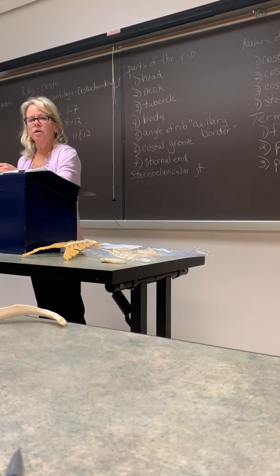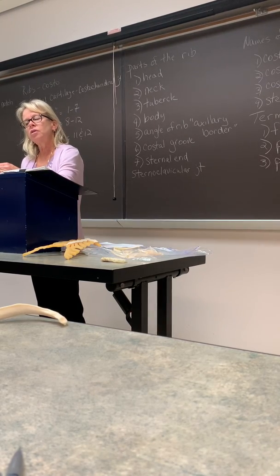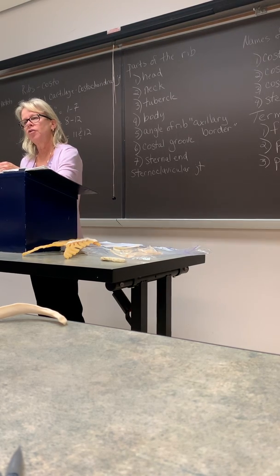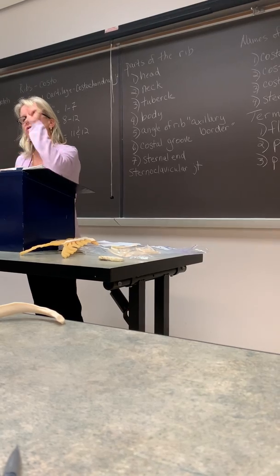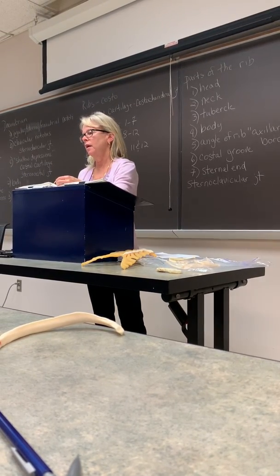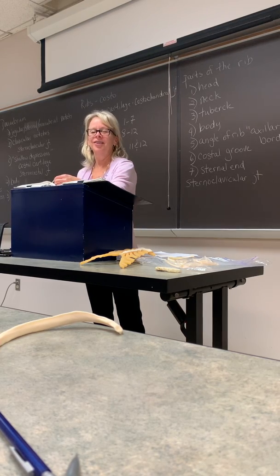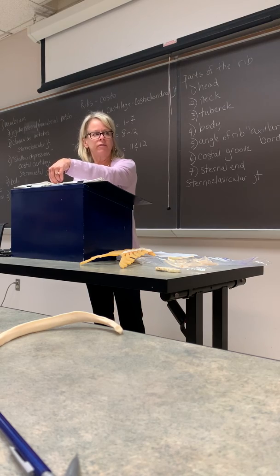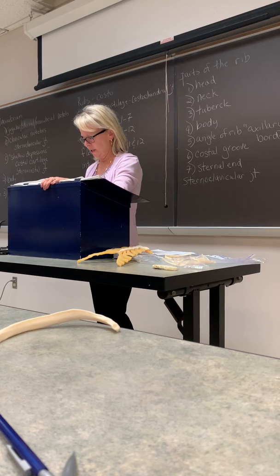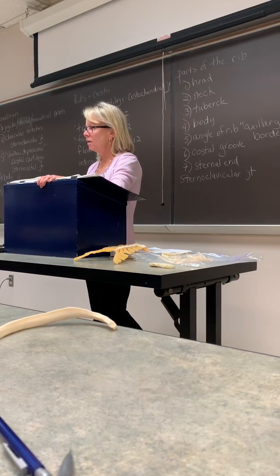Okay, general rules for ribs and sternum first. You should use a low KVP if possible. I know you guys don't set it anymore, but if you hit a sternum and you look at it, it should be a lower KVP. Why do you think? You don't want to penetrate too much. Good. You don't want to over penetrate. They're very thin bones. The sternum and the ribs, they're very thin. Recommendation is 60 to 70 KVP.